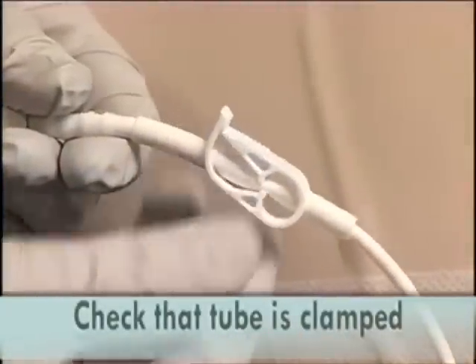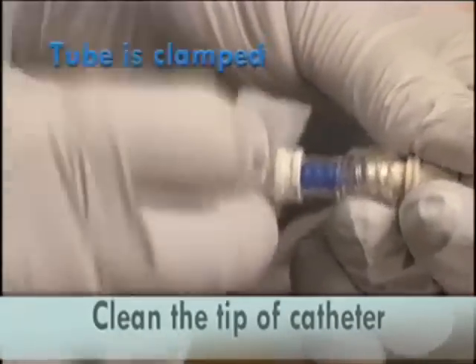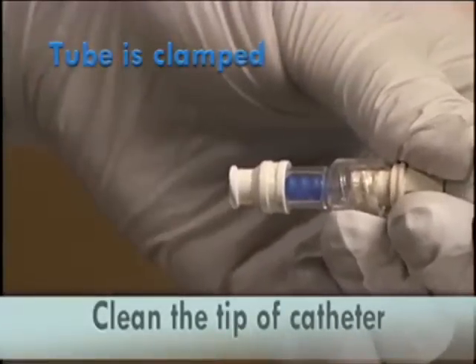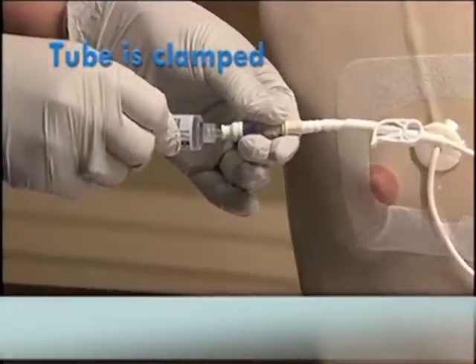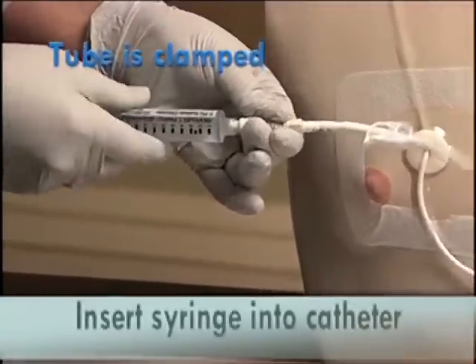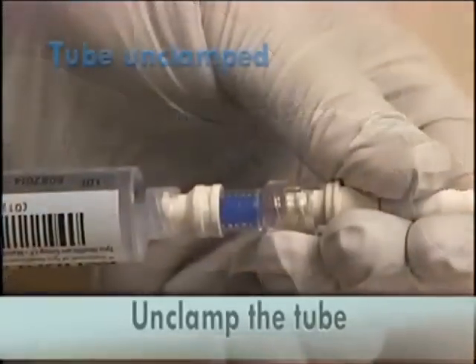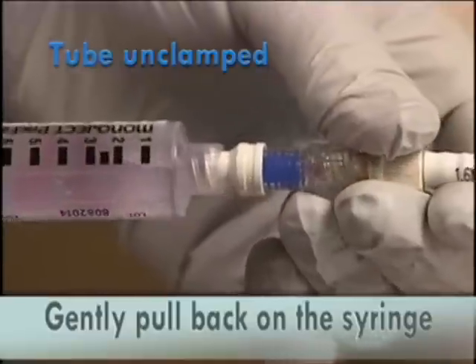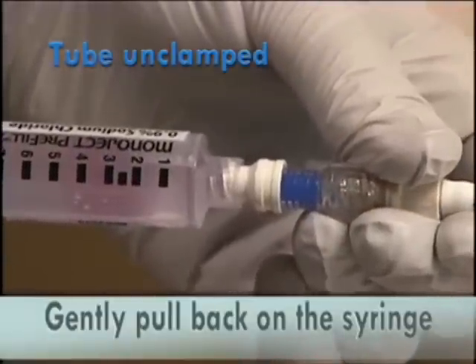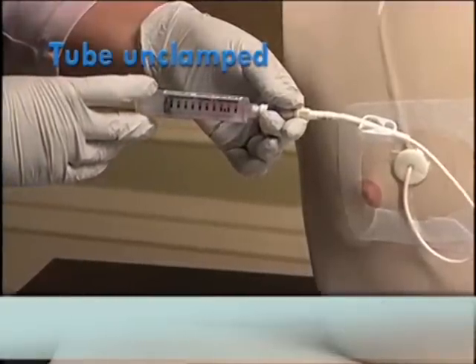Check that the tube is clamped. Thoroughly clean the tip of the catheter with the alcohol pad and hold onto it to prevent contamination. Insert the tip of the syringe into the catheter. Unclamp the tubing and gently pull back on the syringe until you see a flash of blood — this ensures that there is no air in the line.